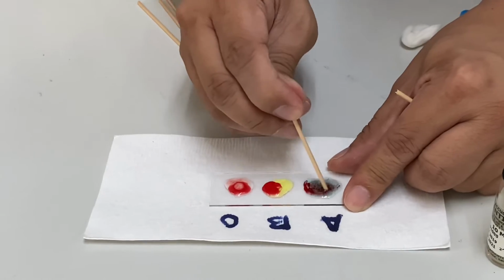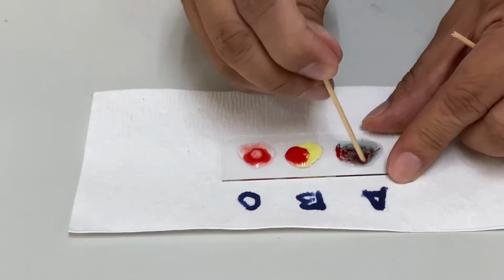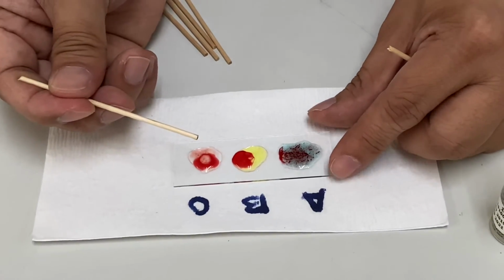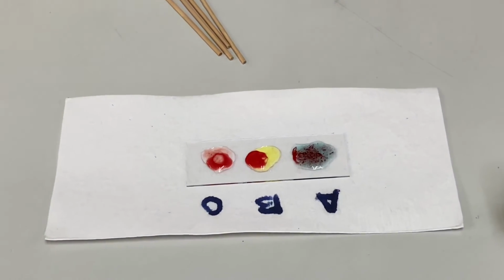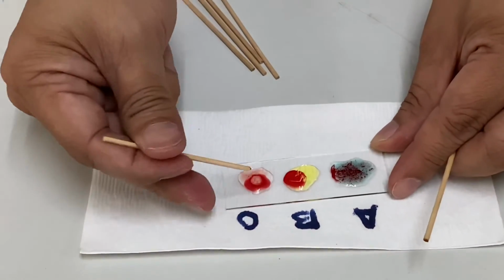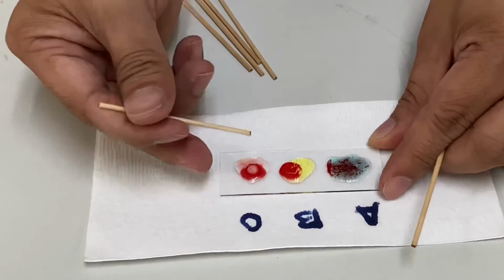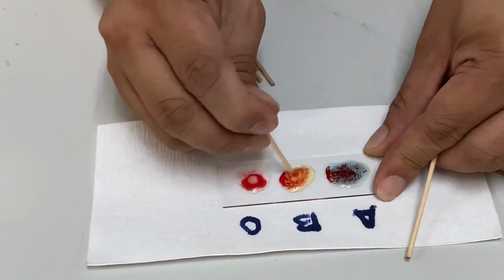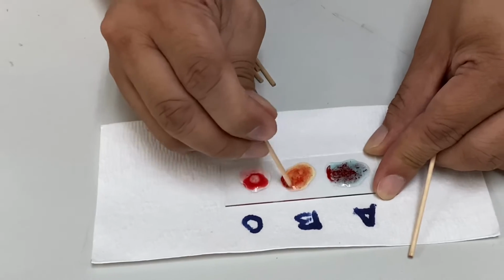Our goal is to see if there is agglutination in here. Now, Von, can you see any agglutination in A? Do you think it mixes thoroughly, or can you see the precipitate in there representing the agglutination?